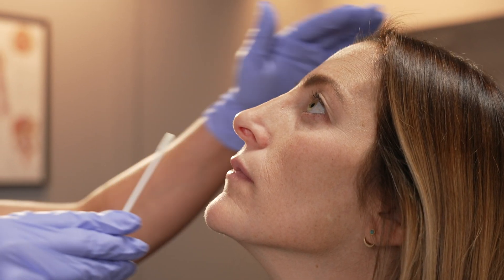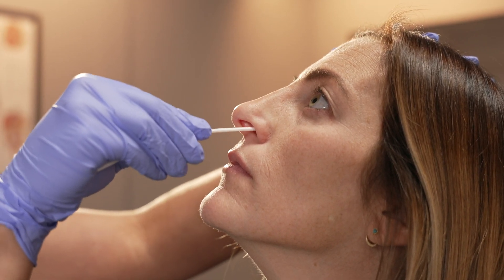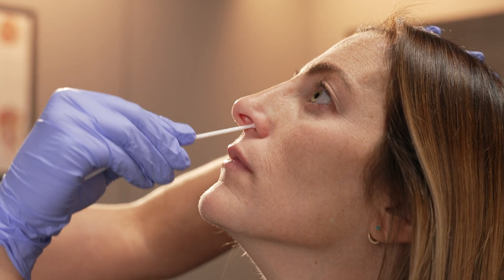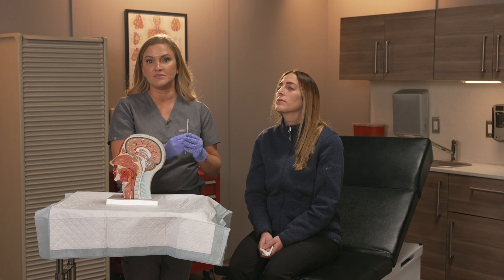Insert the soft end of the swab into the nostril no more than about three quarters of an inch, or 1.5 centimeters, into the nose. Rotate the swab gently. Depending on the test, you may need to repeat this on the other side using the same swab.